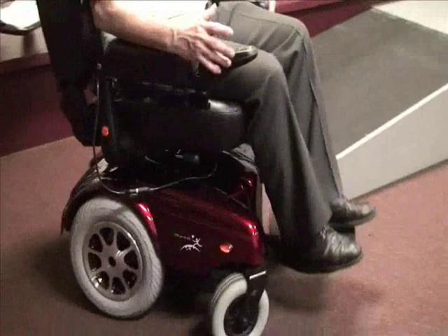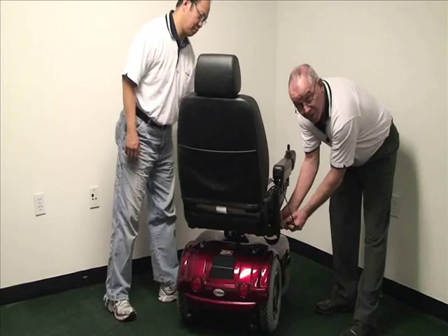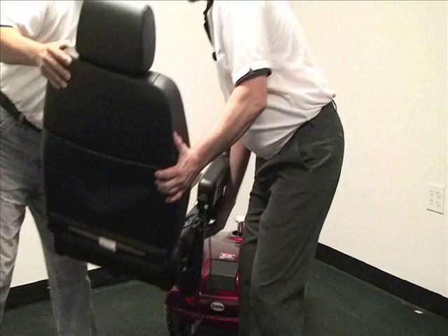With the help of my assistant Ken, I'll show you how to remove the seat, the shroud, and the batteries. First thing you do is unplug the joystick, lift up on the lever on the right, and lift straight up on the seat. It'll come right off.